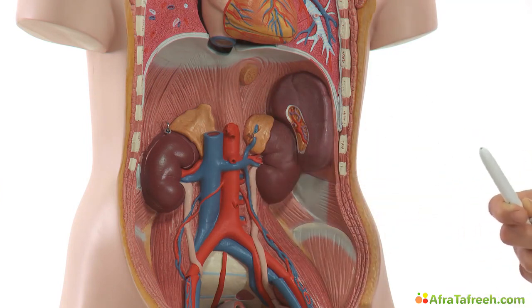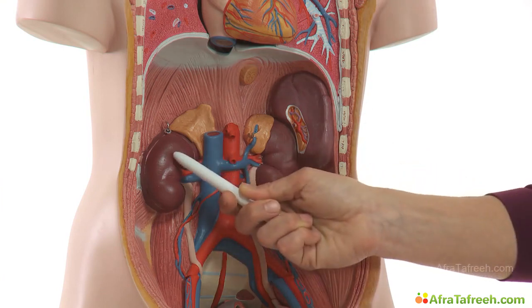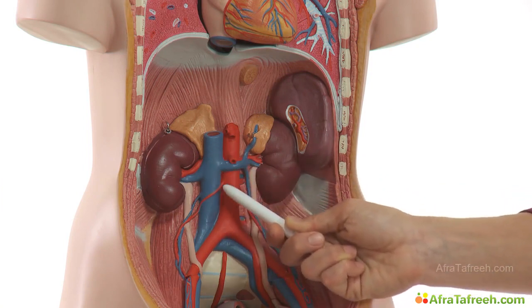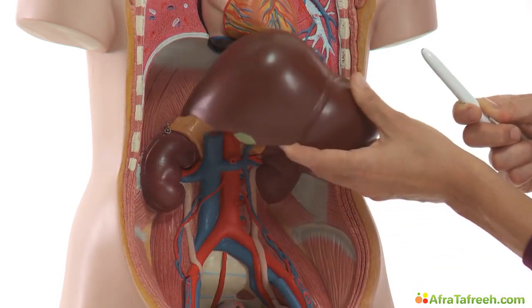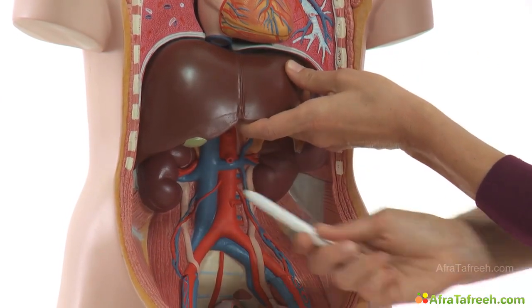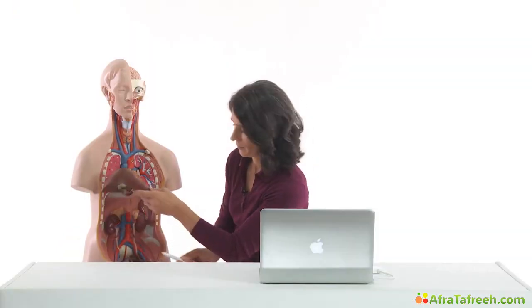Now for the neighboring structures, let's go to the right side first. We got the right kidney over here. And another neighboring structure is the inferior vena cava. And an important landmark to find the adrenal gland on the right side is, of course, the right liver lobe. Here, adrenal gland, kidney, inferior vena cava, and the right liver lobe.